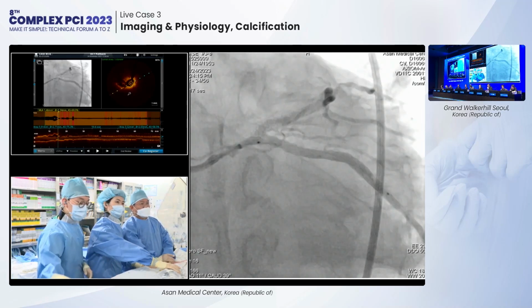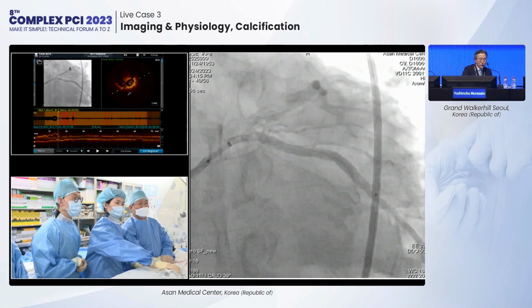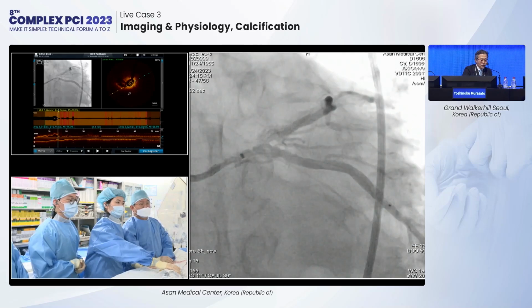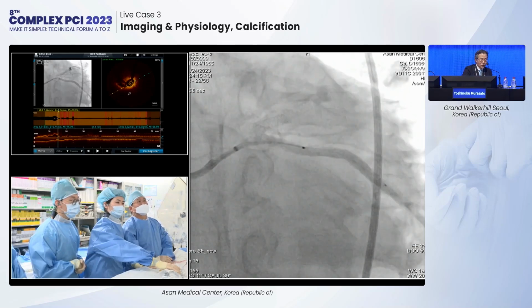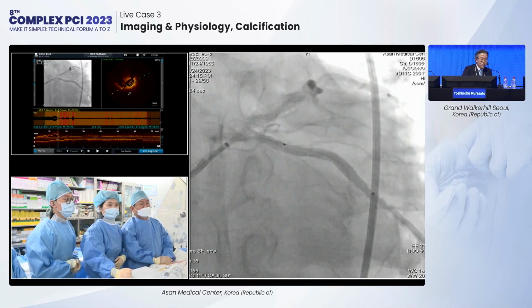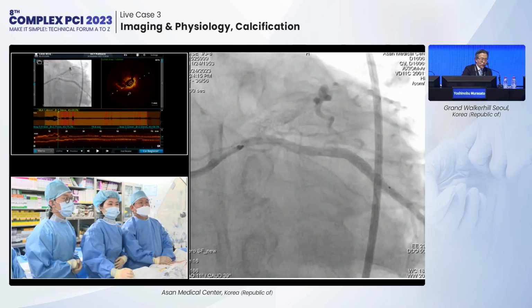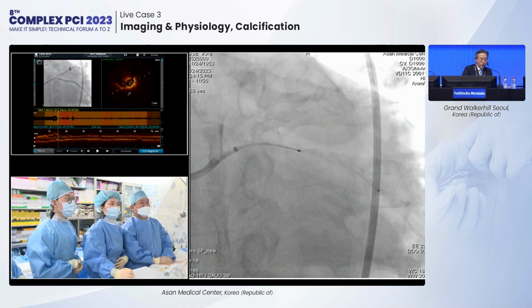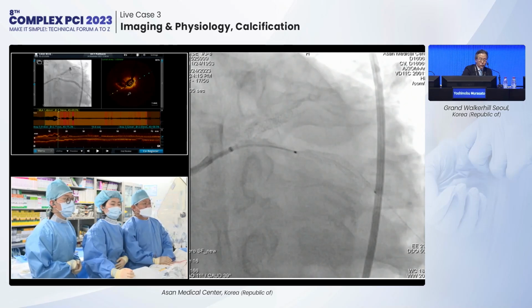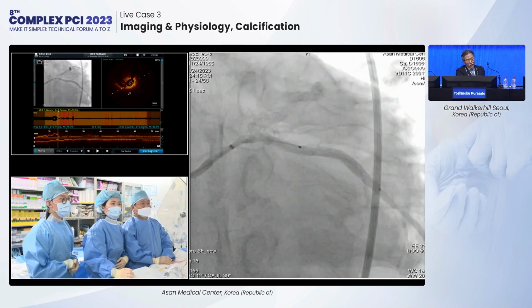I think there is a risk of growing the calcified nodule in this region. After rotational atherectomy, it is effective to ablate the calcified nodule. So stenting is not agreeable to me. So ablation with rotational atherectomy and DCB again. Any other opinion?